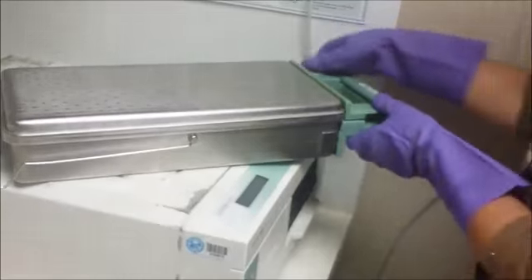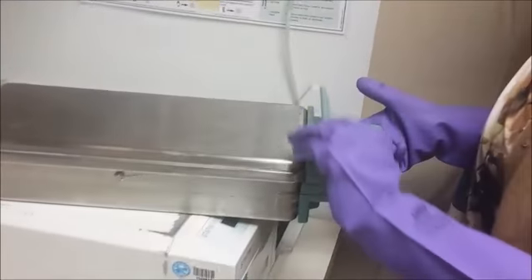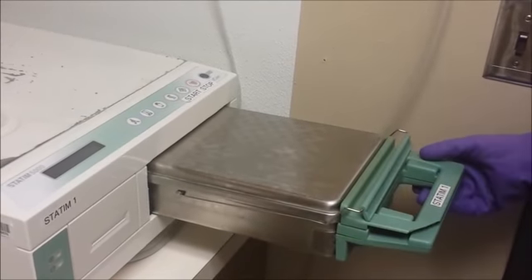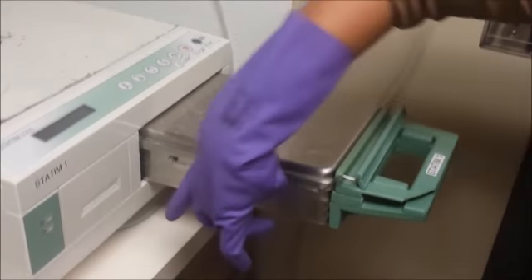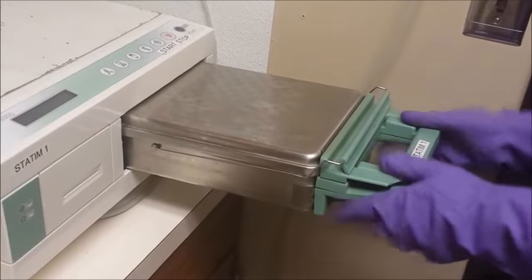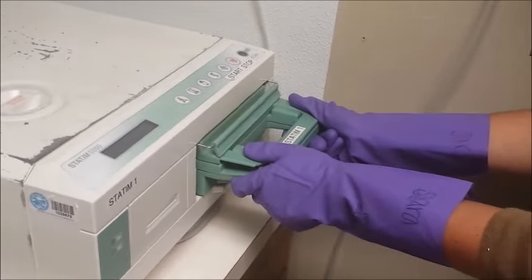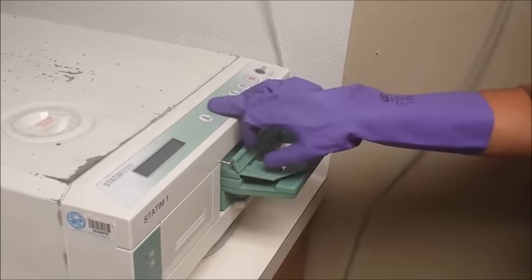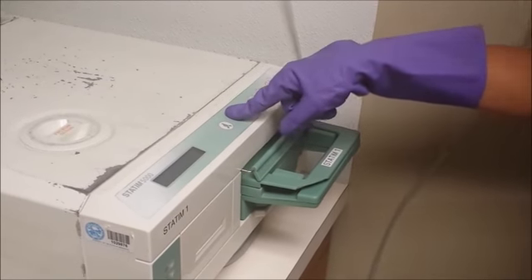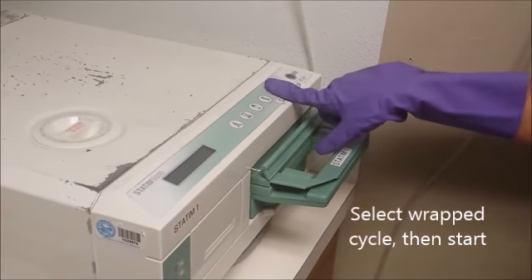Here's how to close the cassette and select a cycle. Pinch the cassette closed, place the arm over the top, and slide it in — making sure it's not upside down. The narrow part is the top and the deep basin part is the bottom. Push it in until you hear a click. Then press the cycle you want — for the most part we'll be selecting the wrap cycle — and push the start button.